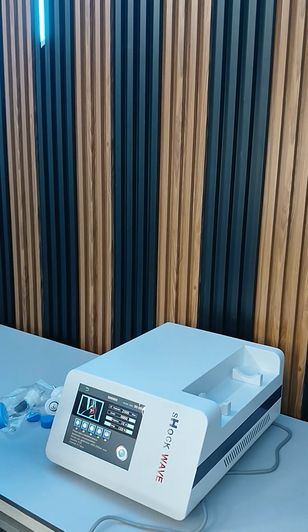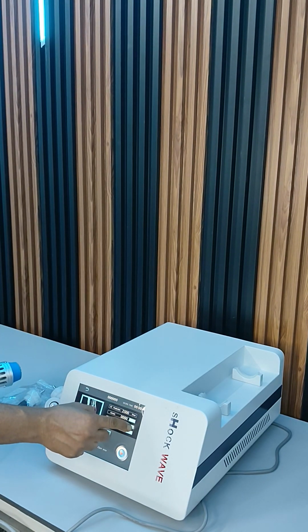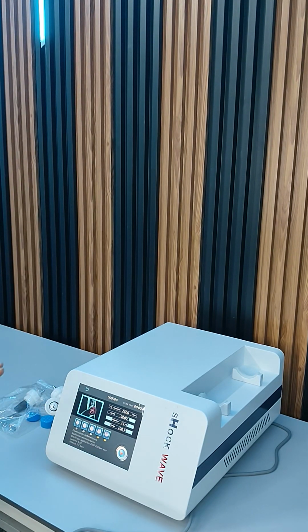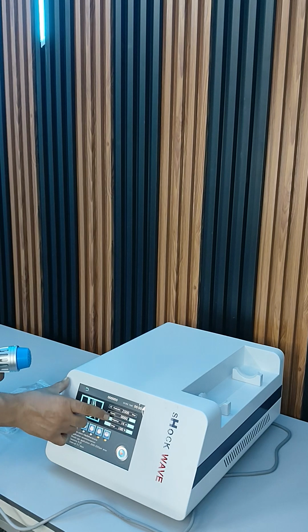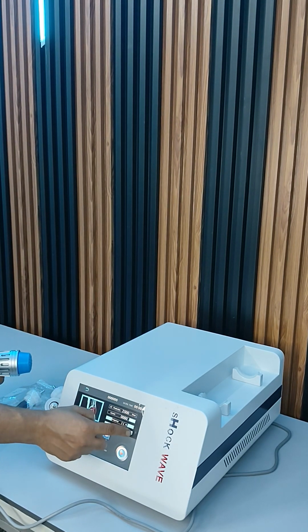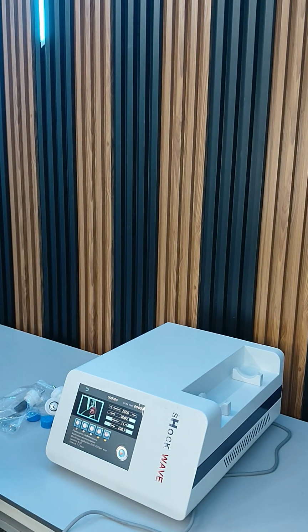But if I increase the frequency to 16, the maximum energy I can go is 100, not 200. If I want to use 200, I need to decrease the frequency, and then I can increase up to 200. So that is how intelligent the device is, to prevent damage to the joint or any kind of injury.